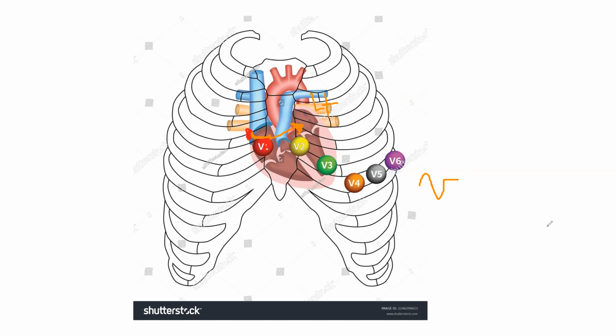If we remember from the first video introduction, we said the electrodes, if the electricity is approaching an electrode, it will give me a positive deflection. And if the electricity is traveling away from the electrode, it will give me a negative deflection.